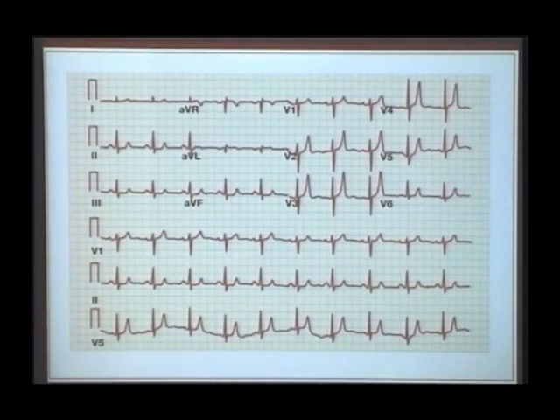Whereas look at this T wave. What's happening to the T wave? See the base, it's so narrow. See the apex, it's an arrowhead apex, so narrow and sharp. So whenever the tall T wave has a narrow base with a very sharp apex, it is hyperkalemia. So this is hyperkalemia. You can see that it is very short.